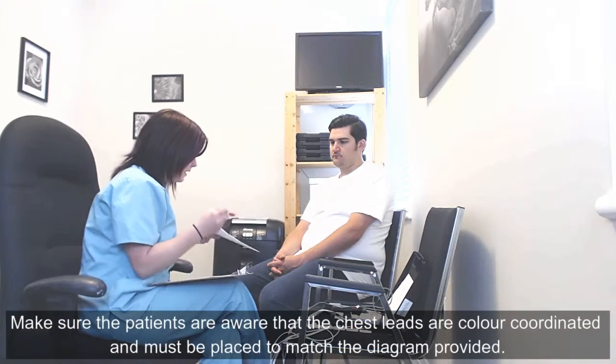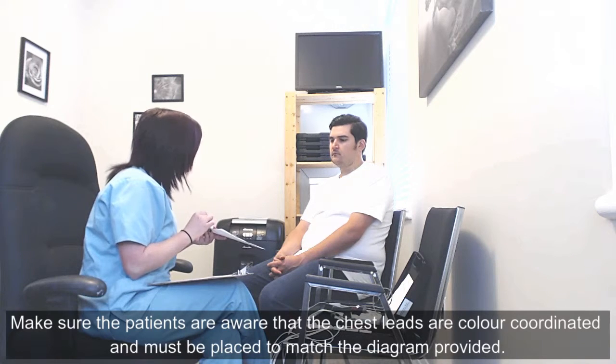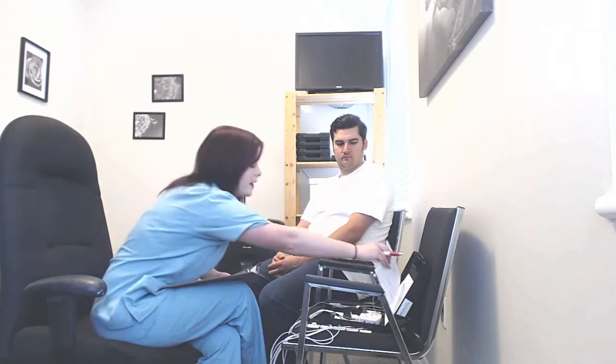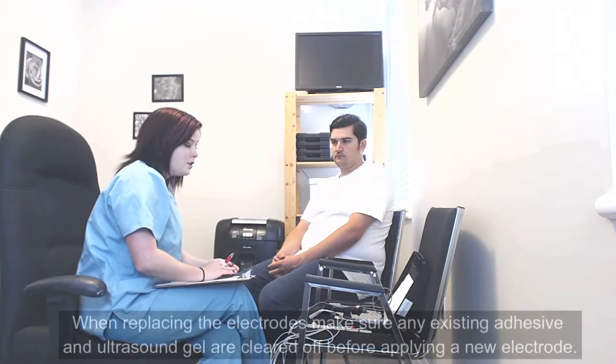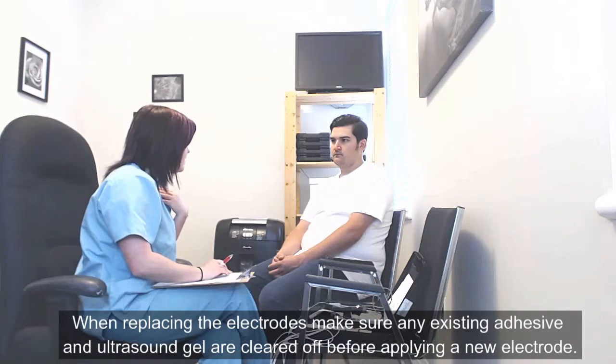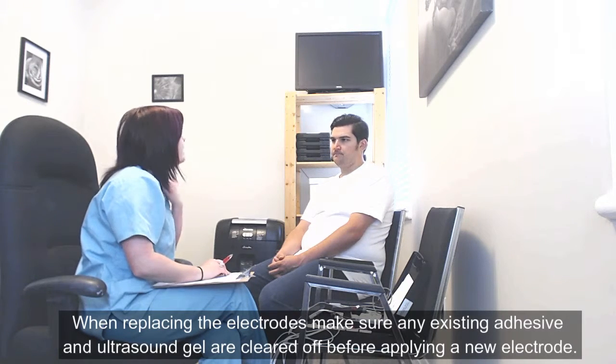When you are hooking yourself back up after your shower, it is color coordinated, so just make sure you get them on your left side and your right side of the body — that will be labeled on the diagram provided in your kit. When you are replacing the electrodes, also make sure you fully clear any of the ultrasound gel and adhesive off, dry it, and then apply the new one on top in the same location.